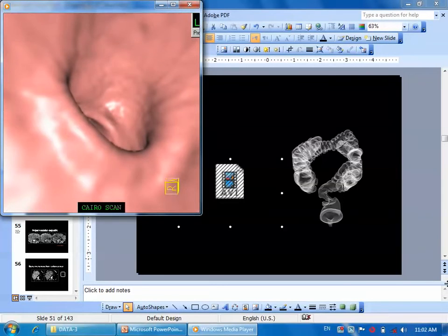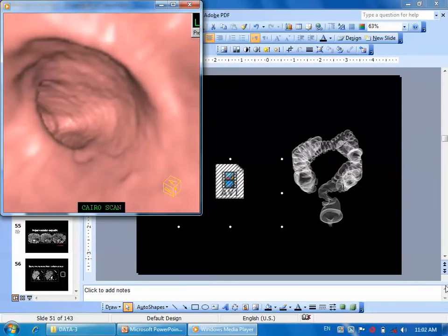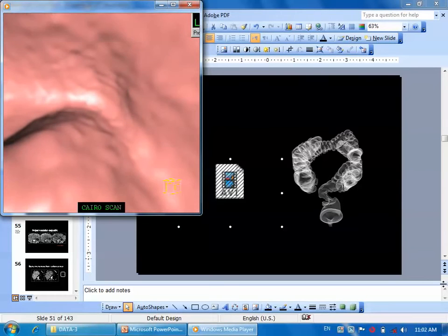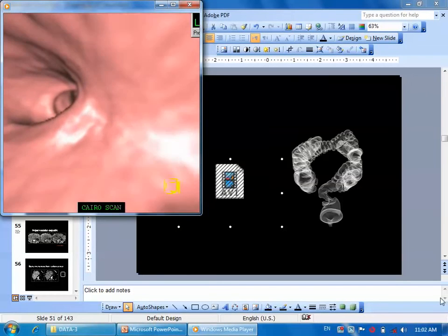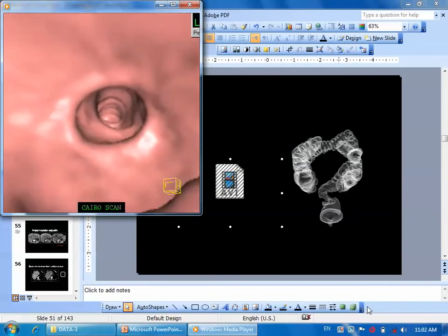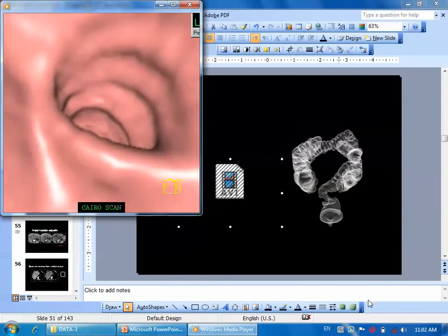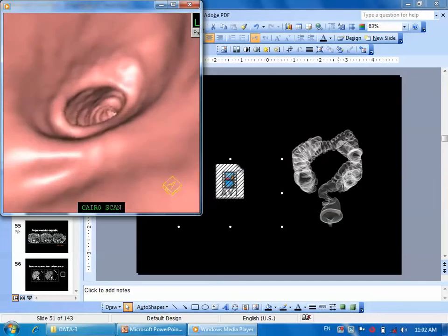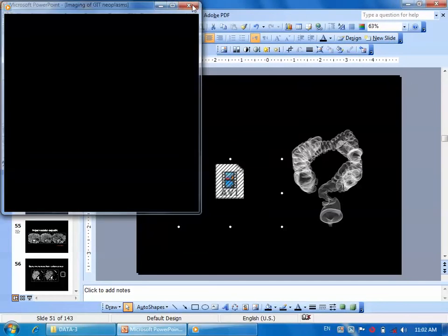And you all know that any subject who is above the age of 50 should have a look at his colon once per year. And there are three ways to look at the colon: the barium enema, the real endoscope, and this virtual endoscope. And most of the patients prefer this very non-invasive technique. We do not touch the patient, apart from injecting his colon with some air in order to distend this colon.